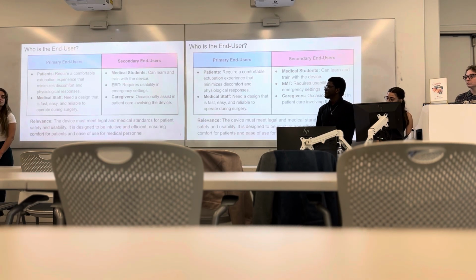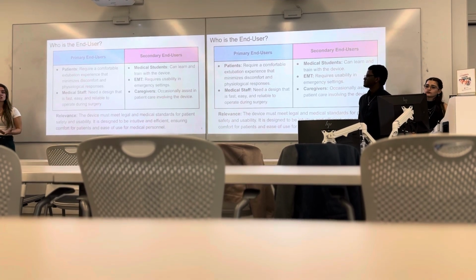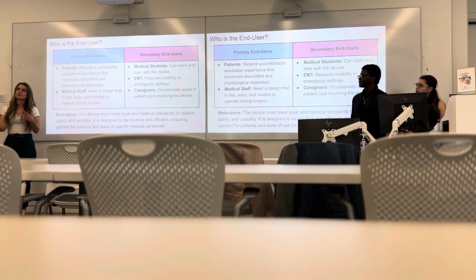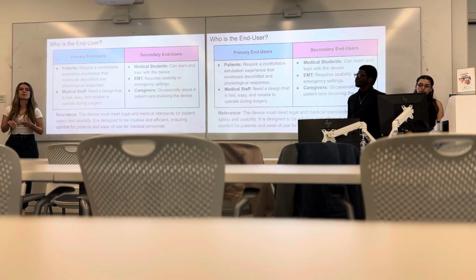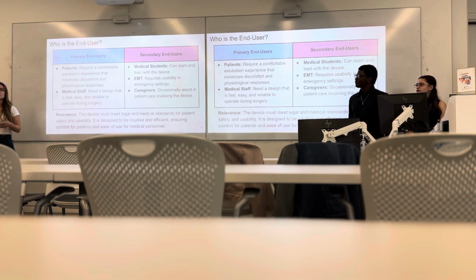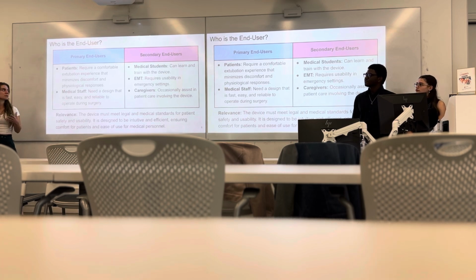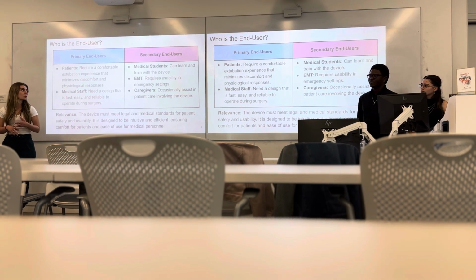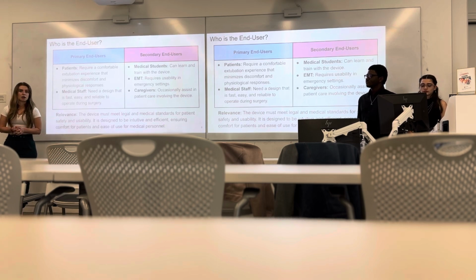So for our end users, we have both primary and secondary end users. For our primary users, we have our patients who are going to be having that endotracheal tube down their throat, so we need to make sure that they have a comfortable extubation experience that'll minimize any discomfort and any other risks associated with that. And then also our medical staff who need a design that's going to be easy, reliable, and fast to operate with during those surgeries.